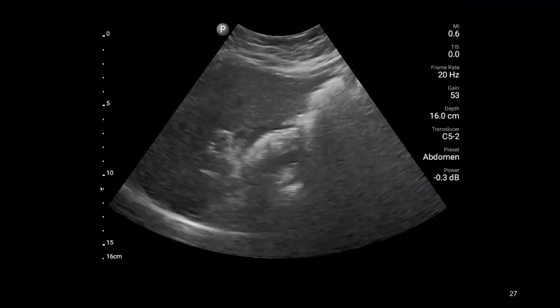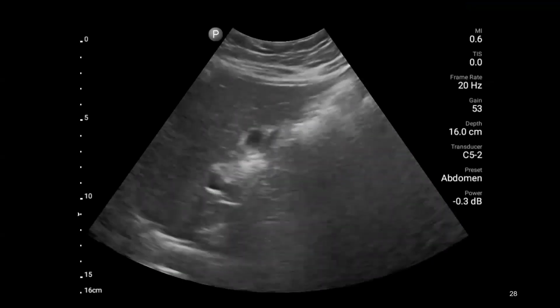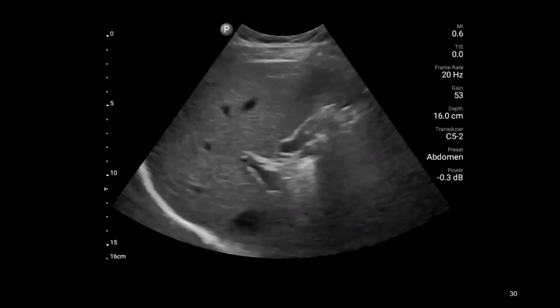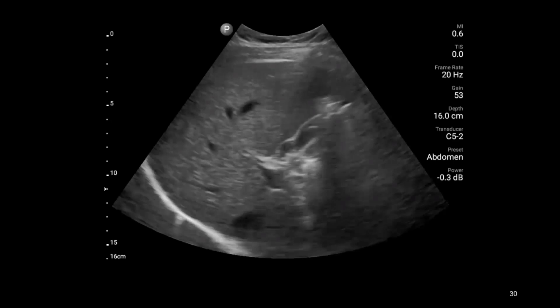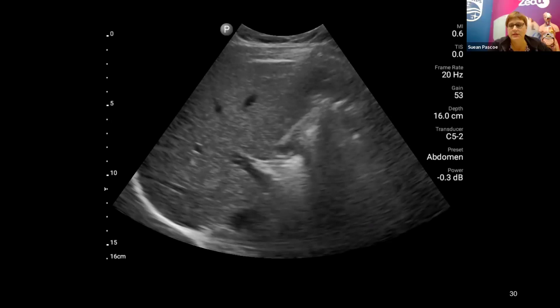Brilliant. Okay. And can I ask one last question? Absolutely. I know that there's a lot of pitfalls when we measure IVC and aorta. If you measure longitudinally, you might underestimate an aneurysm, for example. Do we need to measure the common bile duct in transverse as well as longitudinal, or is longitudinal adequate? No, just in that long picture.